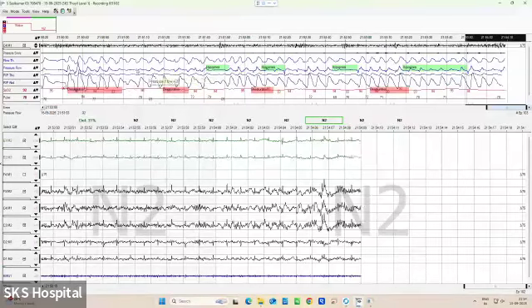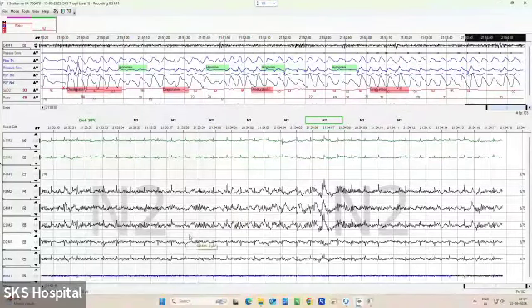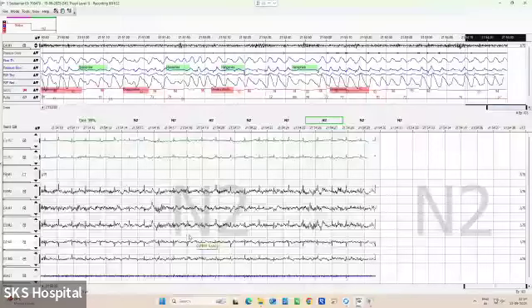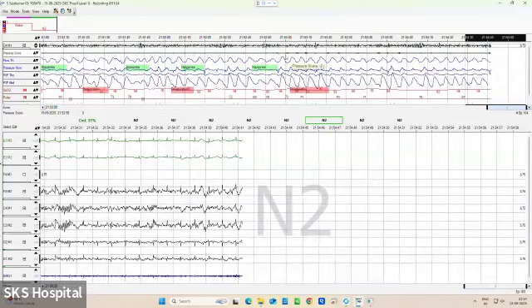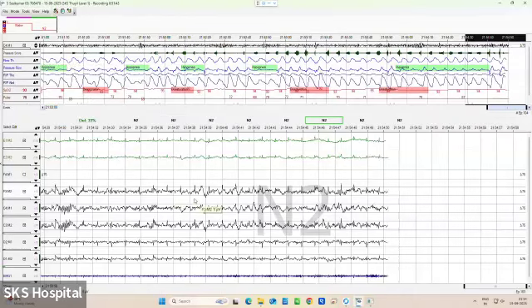In a 4-minute window, you can see almost here 1, 2, 3, 4, and maybe a 5th event. The pressure snore sensor is also trying to pick up snores here. 1, 2, 3. These are all snores that are being picked up. You want to see it clearly? See, the patient has started snoring.